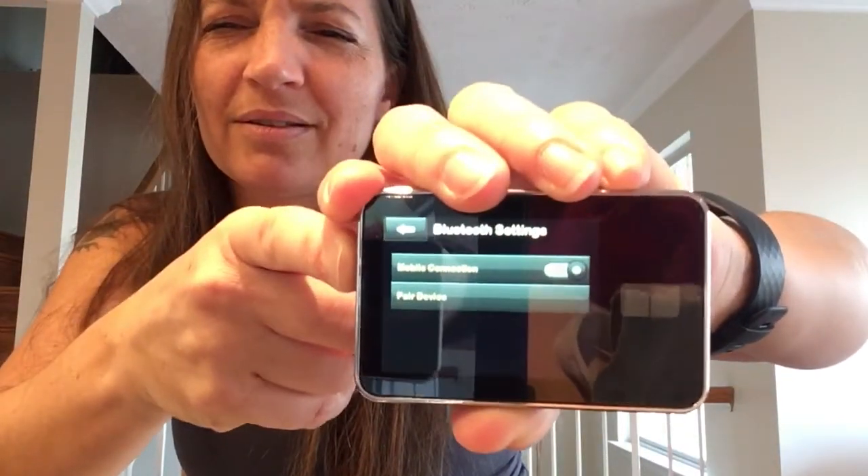Display settings only pertain to the timeout feature on the screen. I always have it set at 30 seconds and I always want to throw my pump because it turns off so quickly, so I'm going out on a limb today and trying 60 seconds. Bluetooth settings — it says your mobile connection, you have to turn it on. I believe that's for the T-Connect app, which I do have on my phone and really like. I'll turn that on and pair that device once I've transferred everything over to this pump.